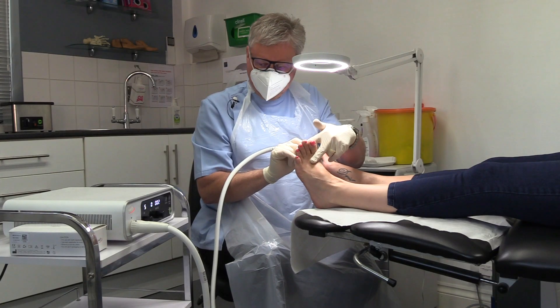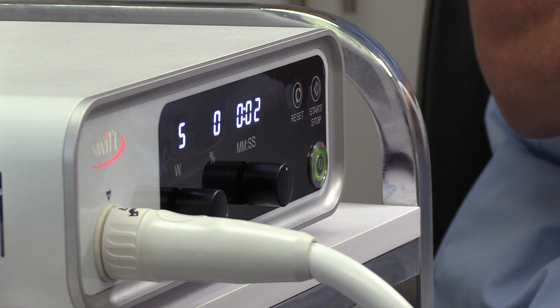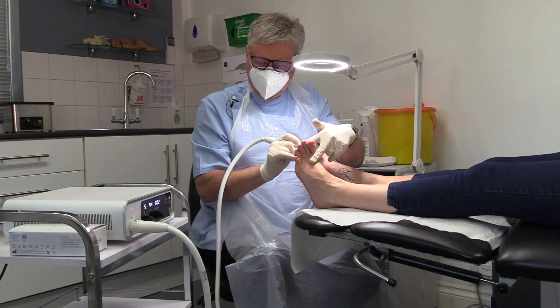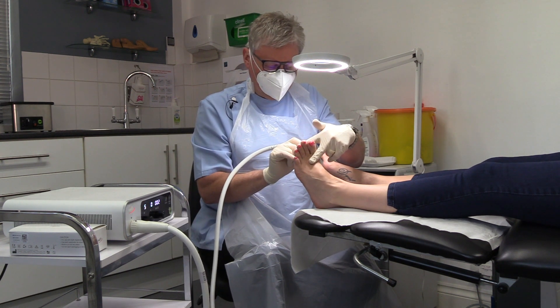Swift is a very successful treatment, and using microwave energy means that it doesn't burn the skin, it doesn't create blisters, and although there is an element of discomfort, that is necessary to show that it's been working.